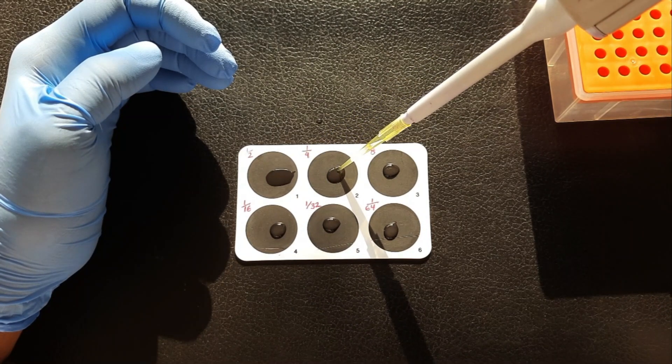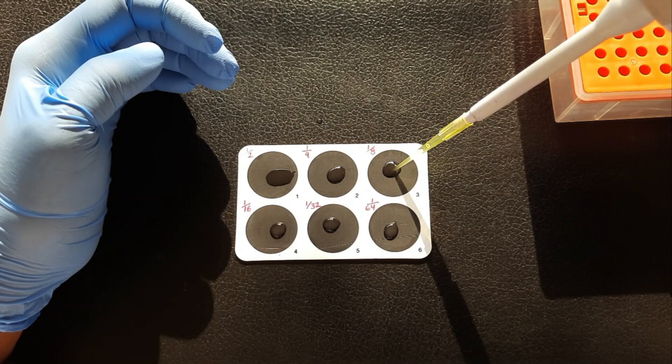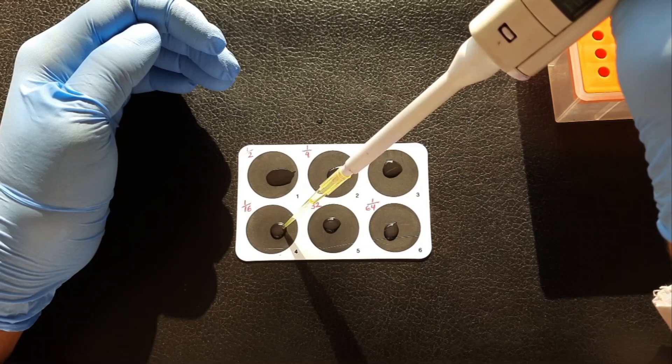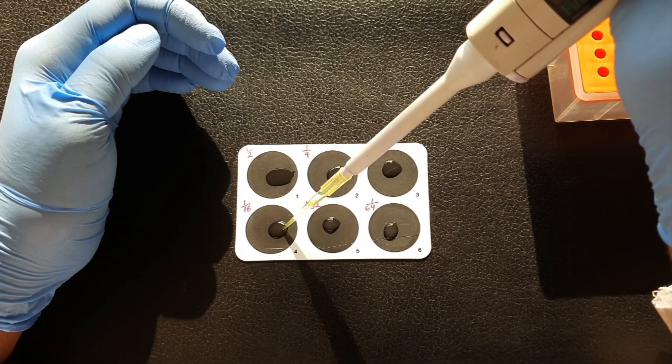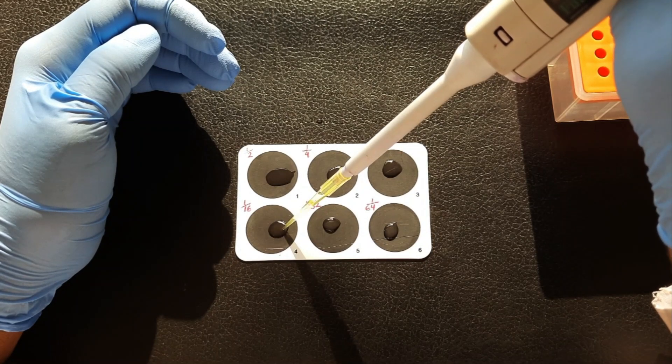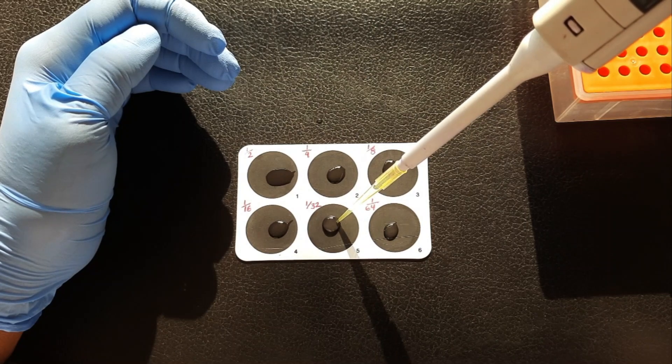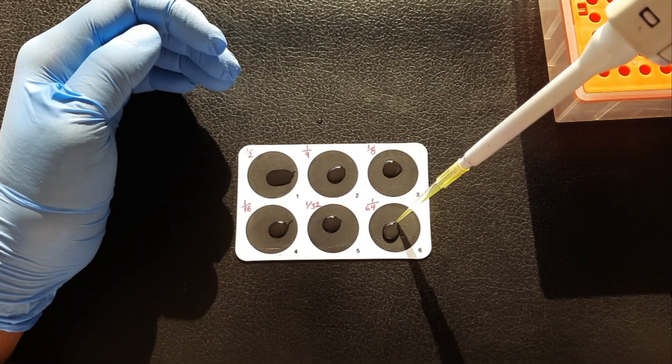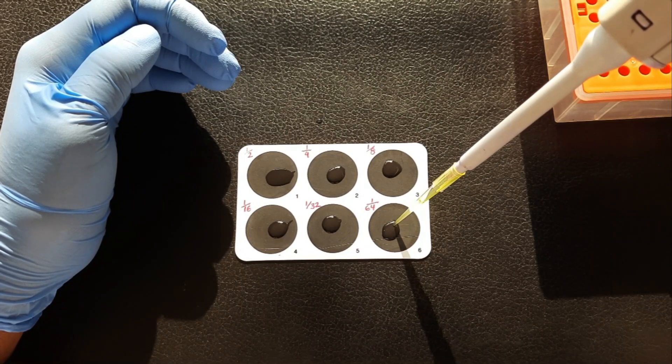Take 50 microliter from circle 2 and place it into circle 3, and mix. Take the same amount from circle 3, transfer to circle 4, mix. Again, take from circle 4, transfer into circle 5, mix. Again, take from circle 5, transfer into circle 6, mix.